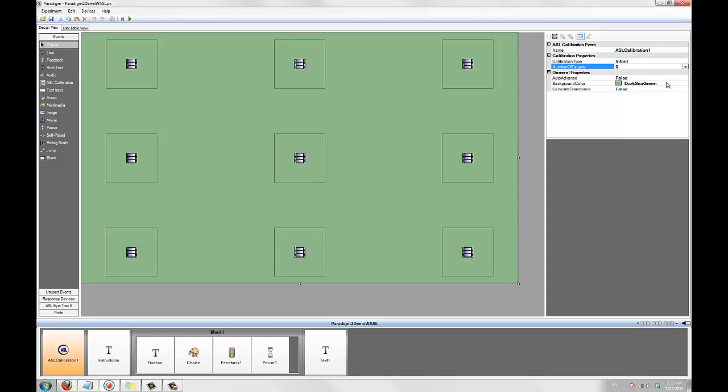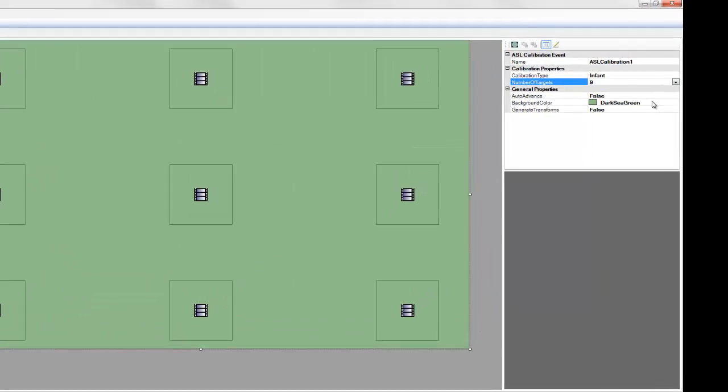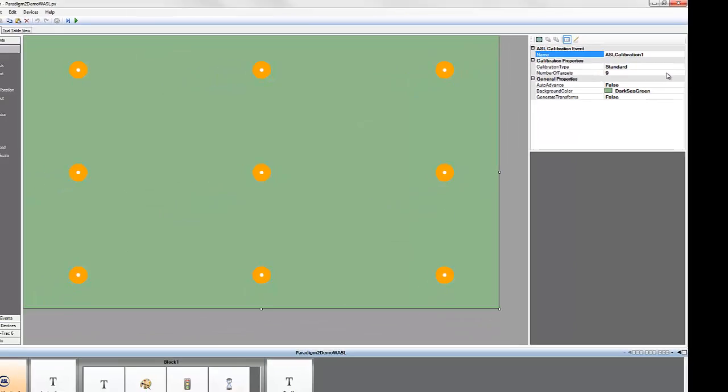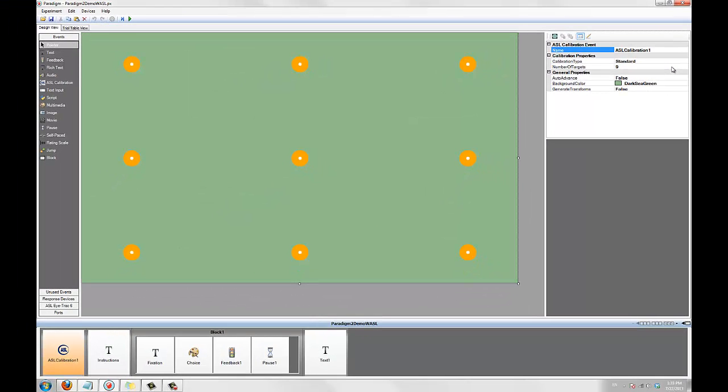We're going to use the standard 9 point calibration for this experiment. When the experiment is run, you'll be able to use the arrow keys on your Paradigm computer to change the current target. Or, if you select Auto-Advance, you can change them using the calibration dialog on your ASL iTrack 6 computer. Auto-Advance requires a serial out port connection.